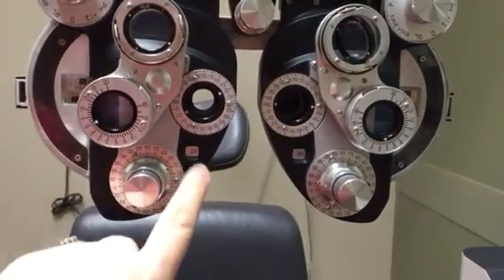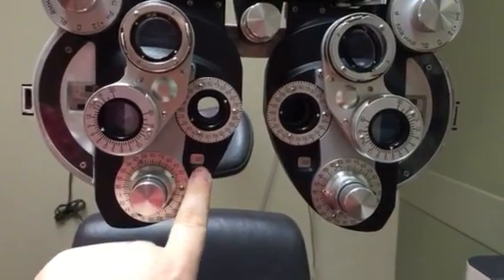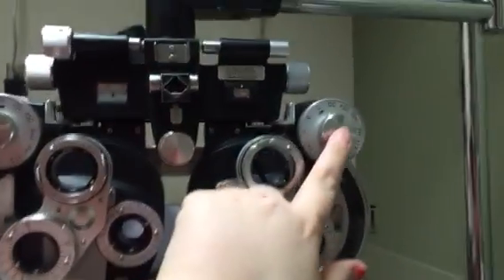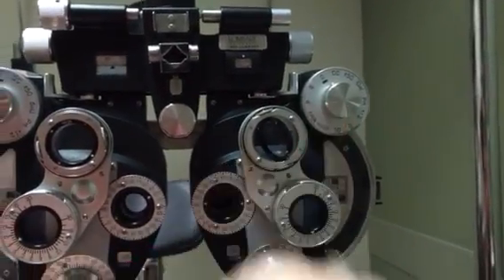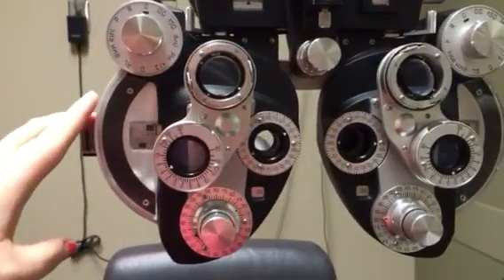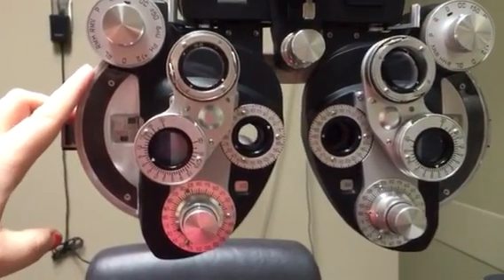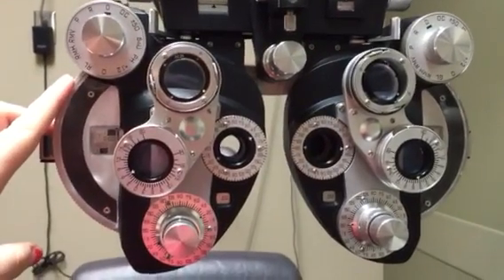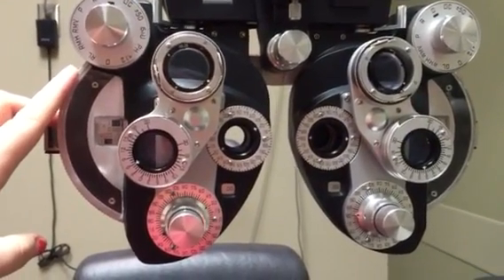You also have your cylinder and your axis adjustment. When you put in cylinder power, you'll see the marking for it here. We'll have the left eye closed and start on the right eye. You'll be seated to the side of the patient so you don't block their view.